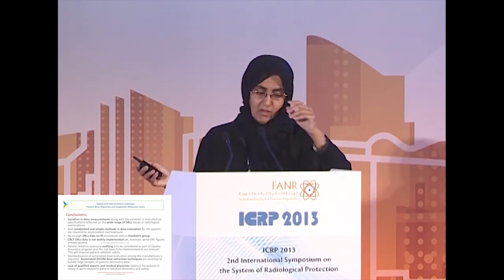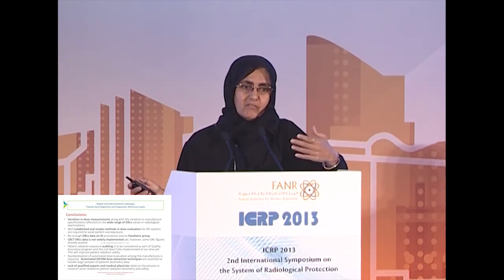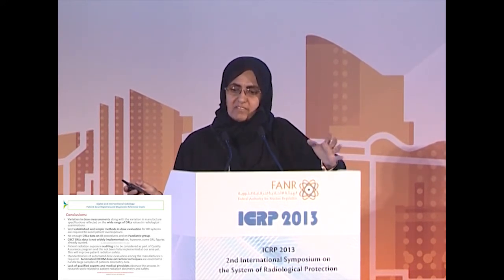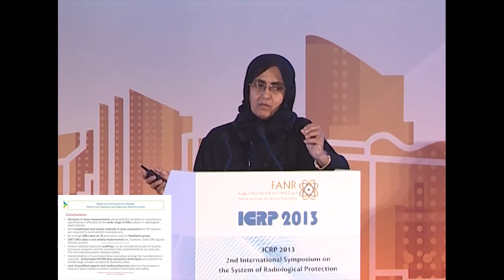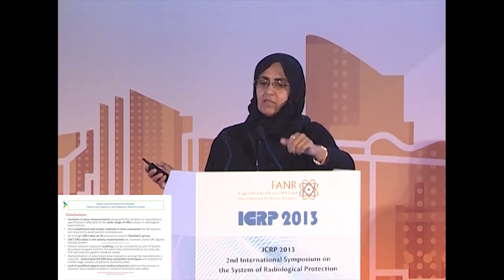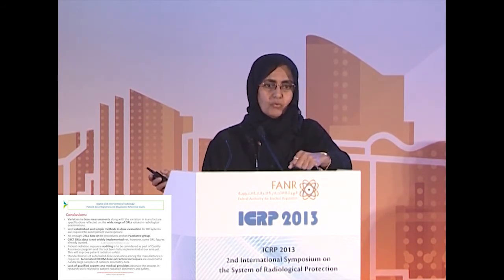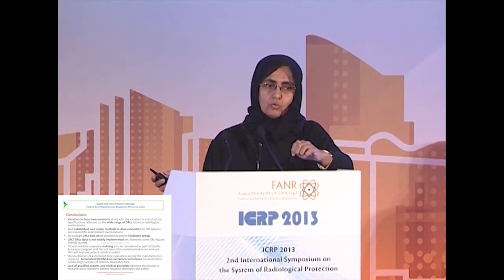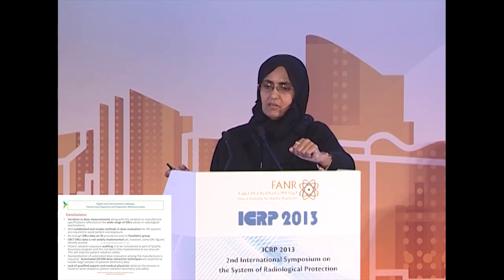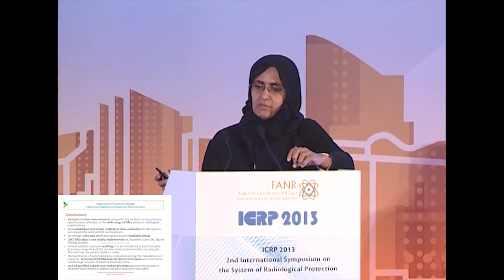So as a conclusion, we see that there is a large variation in those measurements. This is reflecting the variation of manufacturers and the methods used. Also, there is a need to establish a simple and well-established method for those measurements, so it's easy to compare the doses. DRLs for interventional radiology still need a lot of work to be done on it, especially the pediatric group. The cone beam CT, which was mentioned by Dr. Rehani, also because it's a new technique in our area, we have not touched it yet.